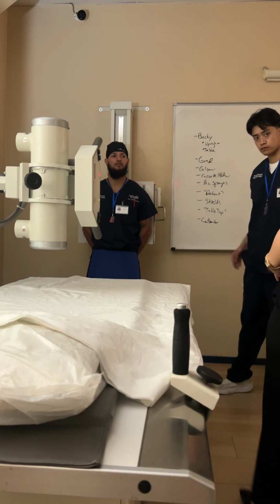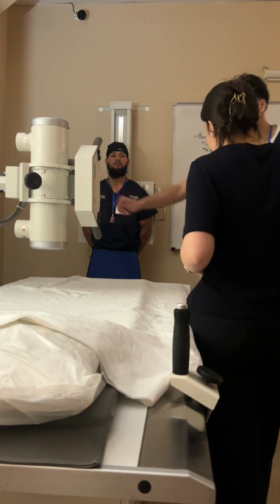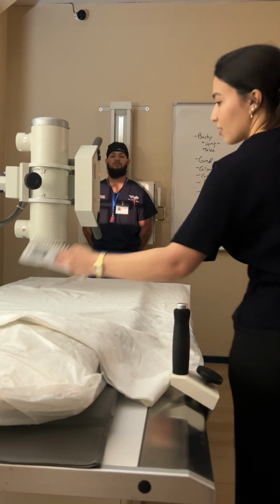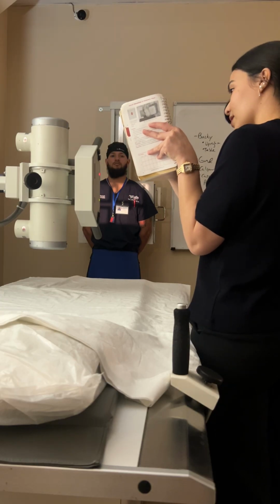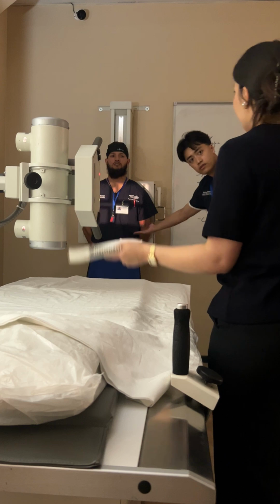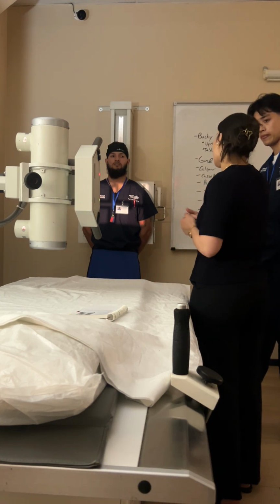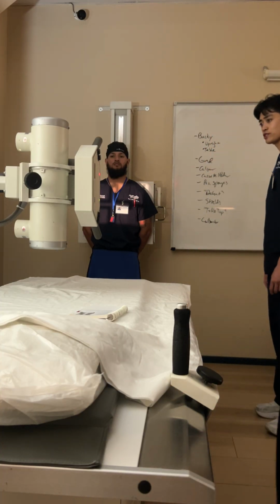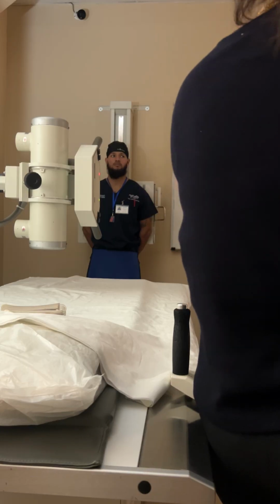Sorry, guys. Got tied up doing markers. So we're at 72 inches, yes? We are detented to the center of that wall bucky, yes? Let's see here. There we go. Feel that, okay? There's a little click and a little drop into a little track there.